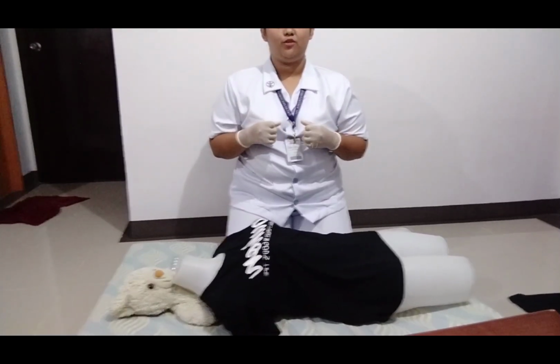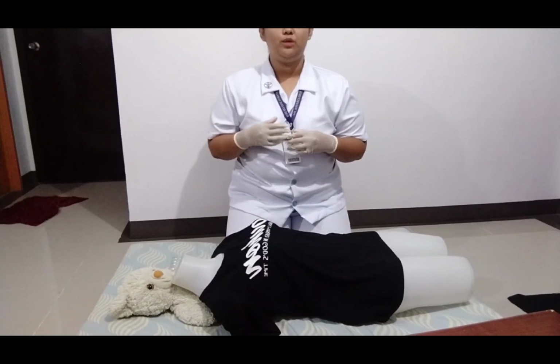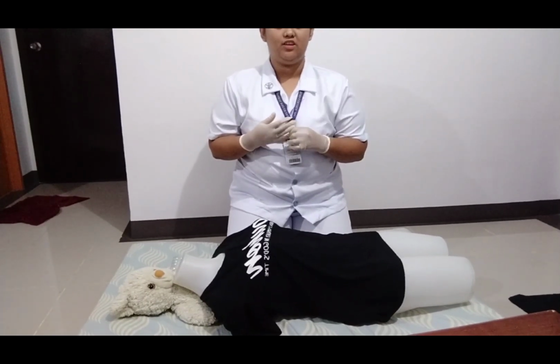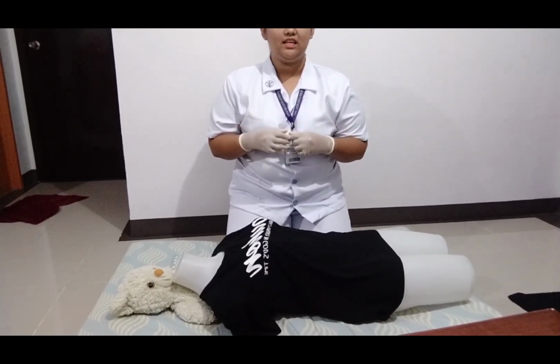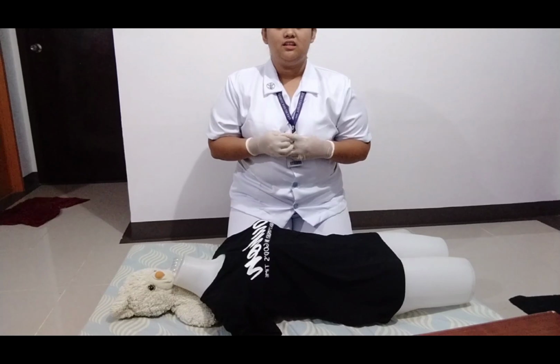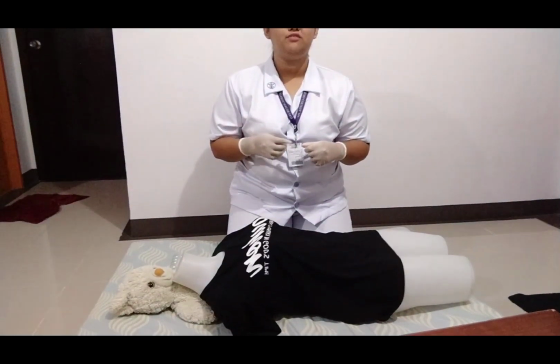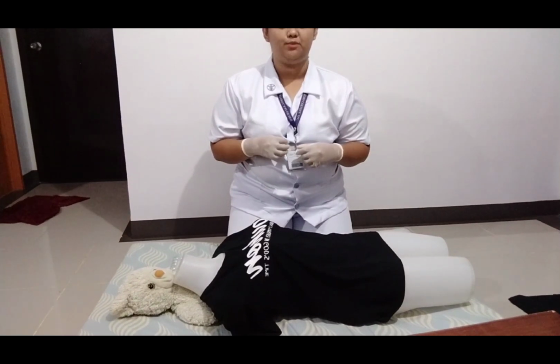Now, I'm going to perform the adult cardiopulmonary resuscitation and AED skill. I am going to begin with the assessment and activation. So I arrive on the scene and I see that the patient appears to be unconscious. The first thing that I'm going to do is to scan the area. Left, right, up, and down. Check the environment for any hazard present.